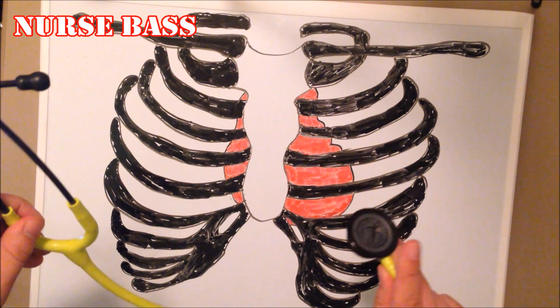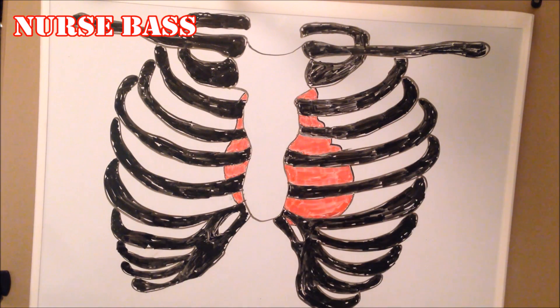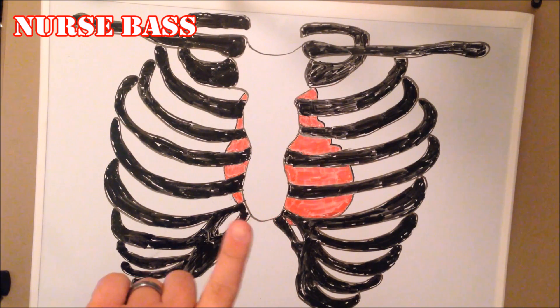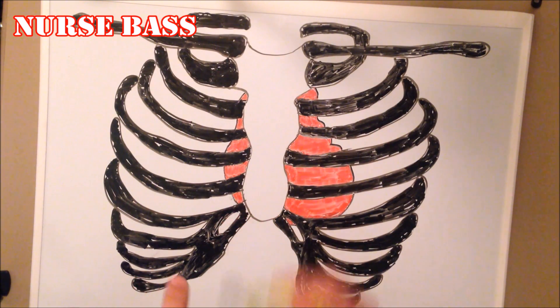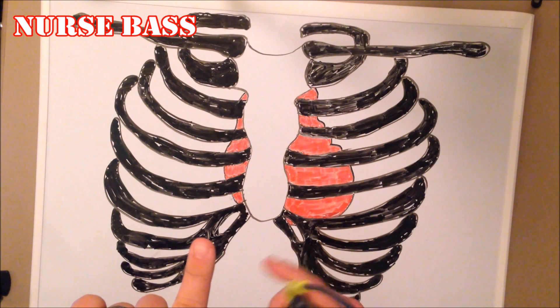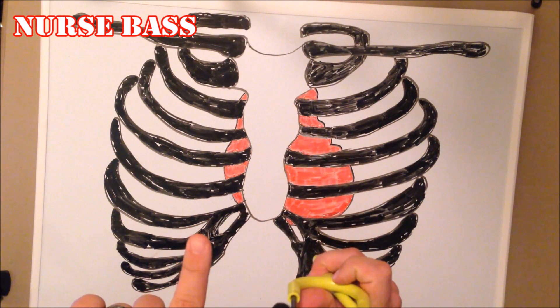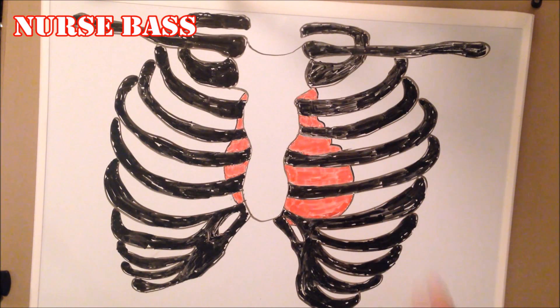The diaphragm is what we need to use in order to auscultate a patient's heart sounds. One simple tip for beginners: if the tip of your finger represents the tip of your nose, that's the direction you point the ear pieces when inserting them — angled forward, not straight in.